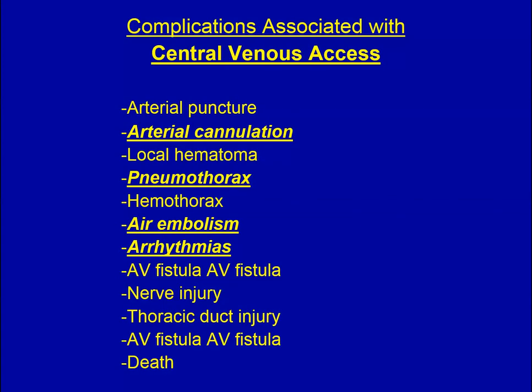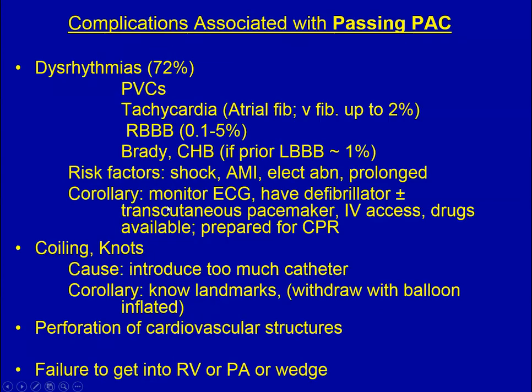On this slide, I have summarized the well-known complications of central venous access, which you are well familiar with, and underline the most important, all of which are operator related and should be prevented by proper technique.